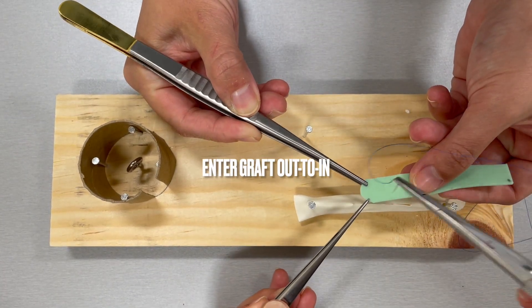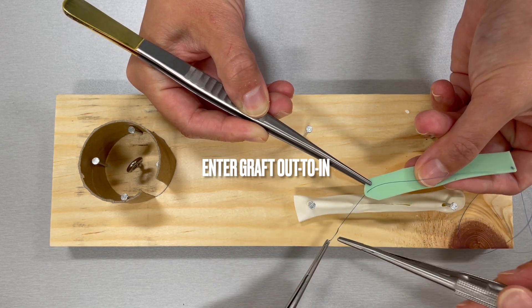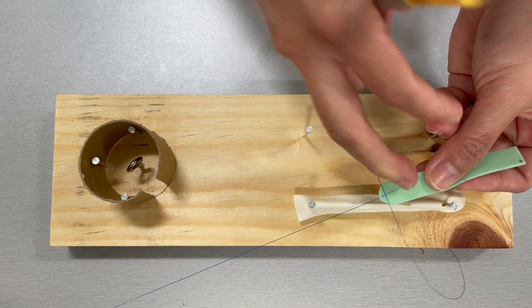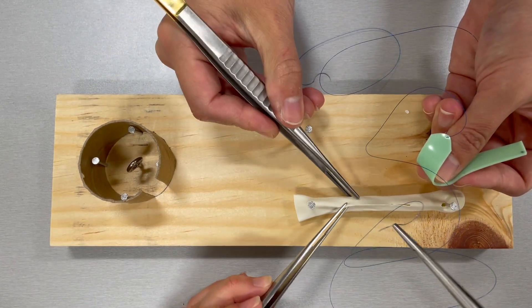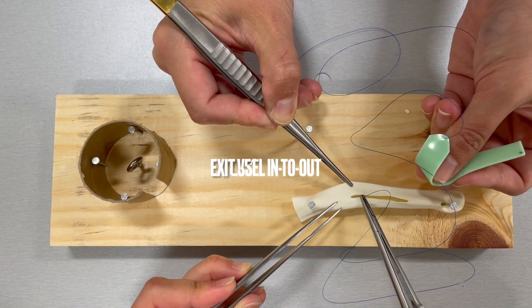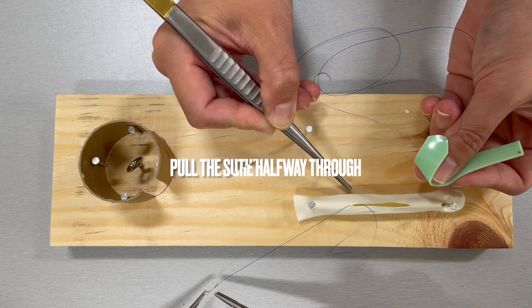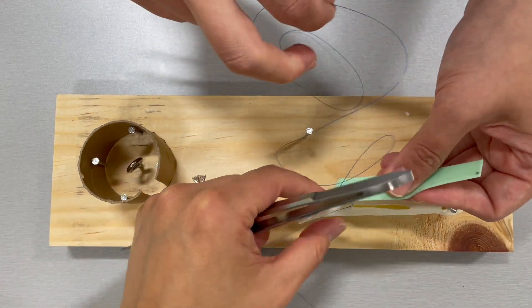With a proline suture, enter the graft out to in, followed by the vessel in to out. Pull the suture halfway through. Tie the suture down.